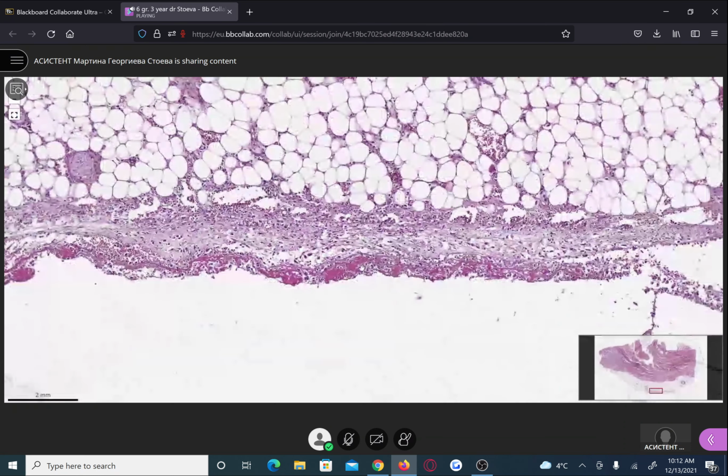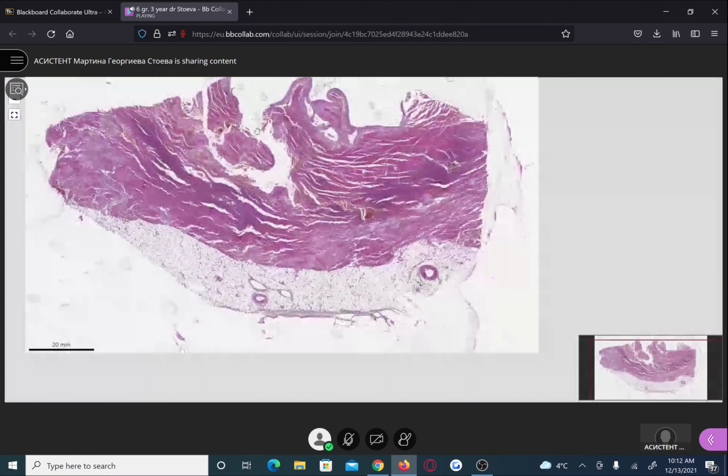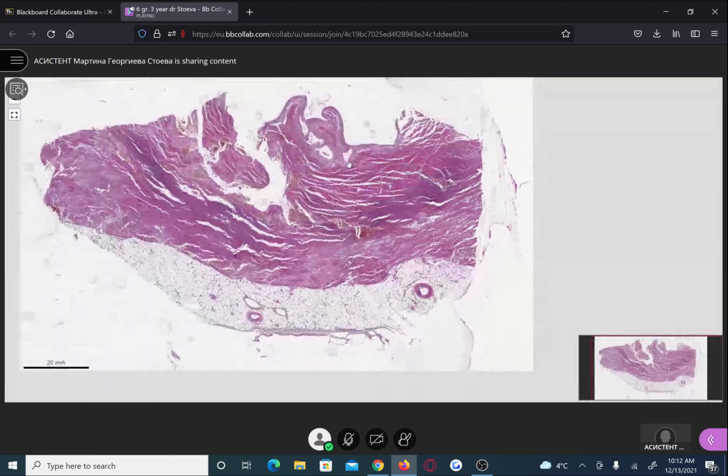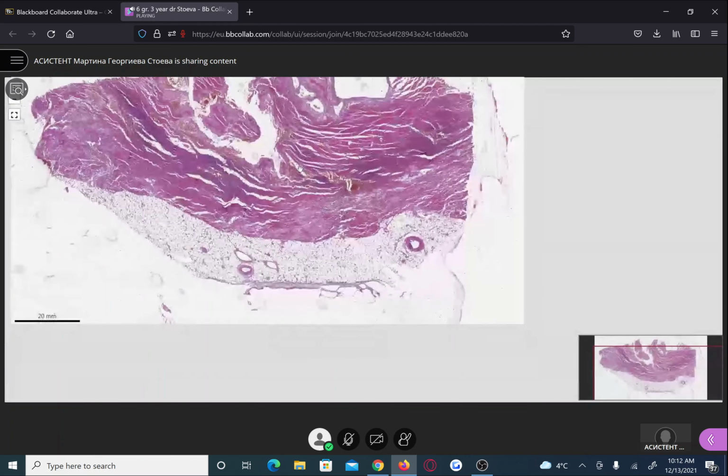Don't forget that next to the area of myocardial infarction, in the lumen, there could be formation of a thrombus. We already mentioned it. Here on this slide, thrombus is not visible. But on the outer side of the slide, on the other side of the heart, again, next to the myocardial infarction on the pericardium, sometimes fibrinous pericarditis is formed.